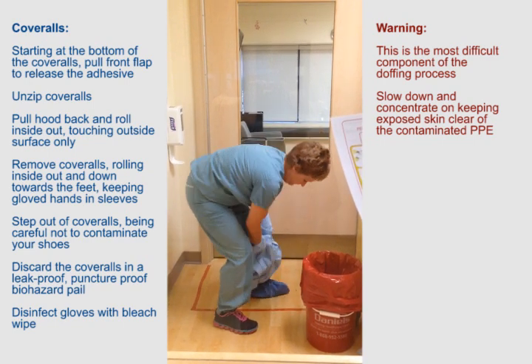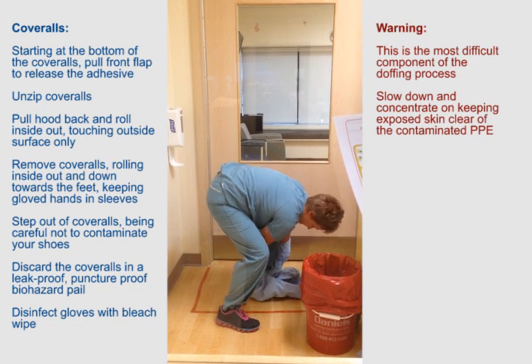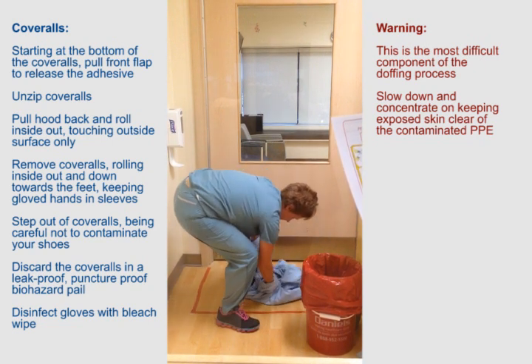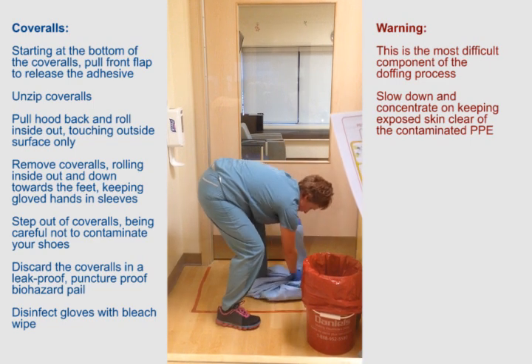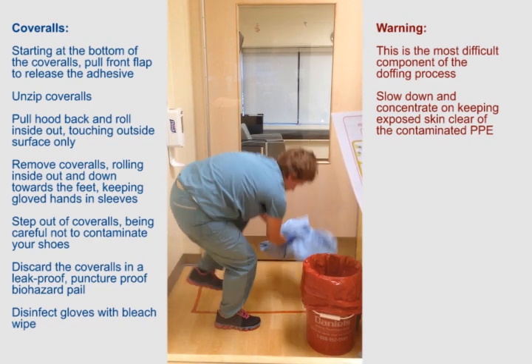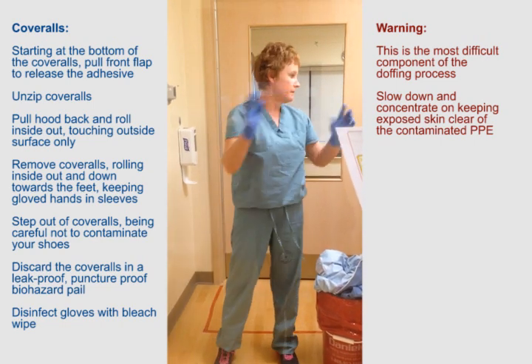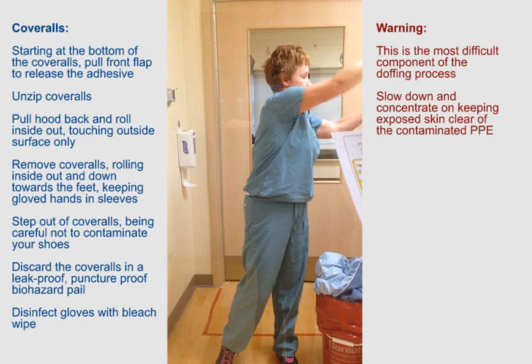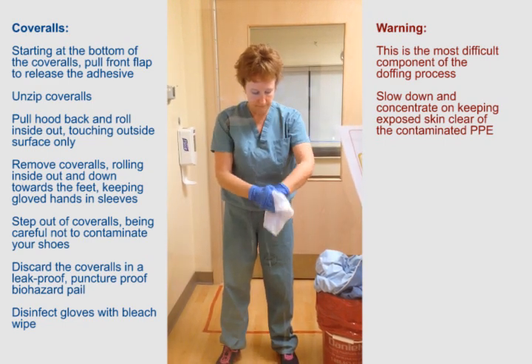Step out of coveralls, being careful not to contaminate your shoes. Discard the coveralls in a leak-proof, puncture-proof biohazard pail. Disinfect gloves with bleach wipe.